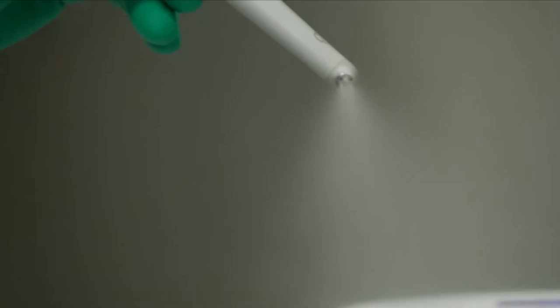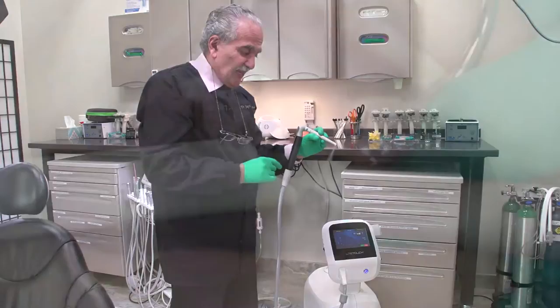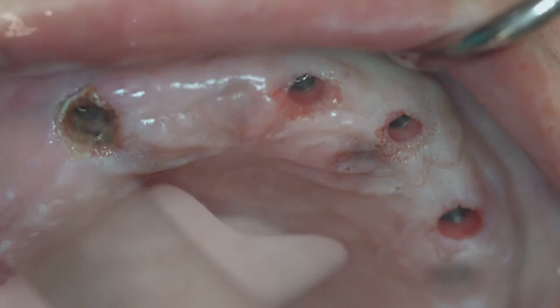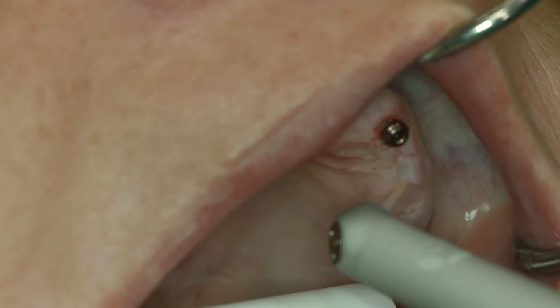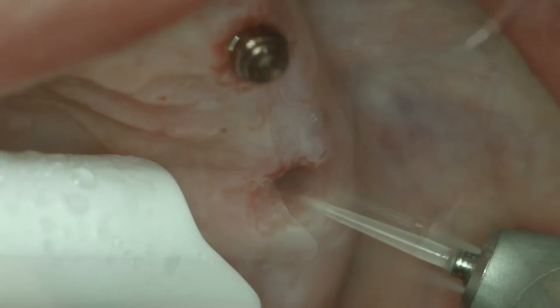I'm going to demonstrate going directly into the mouth, going around some abutments, then taking the abutments out and putting in the final abutments. If it's not exactly what I want, I can actually take a little bit more off. It clots very nicely. I had four implants and four abutments, and the sulcus heights were actually six and eight millimeters.